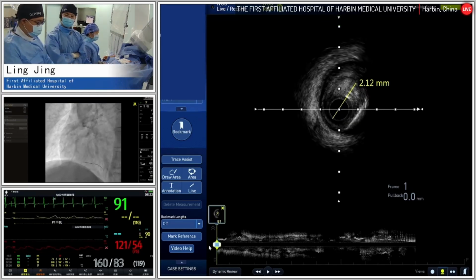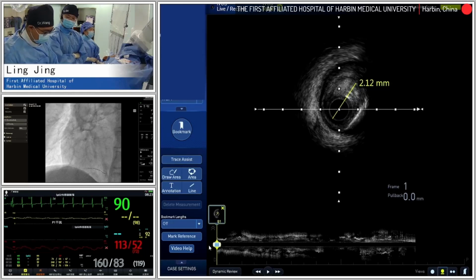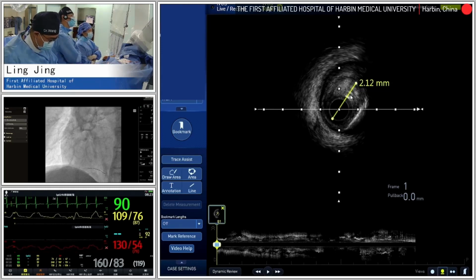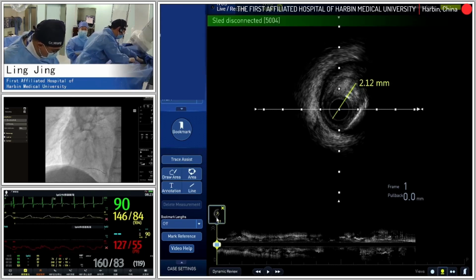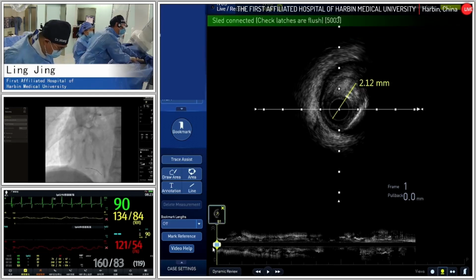Here is something for the CTO vessels: for CTO lesions, the majority of the time after initiation of the recanalization, the distal part of the vessel is shrunk because there is a spasm or something during the long time occluded. So the artery size might not be observed at the normal situation. Sometimes after some follow-ups or after some vasodilators, the vessel size could be dramatically increased.